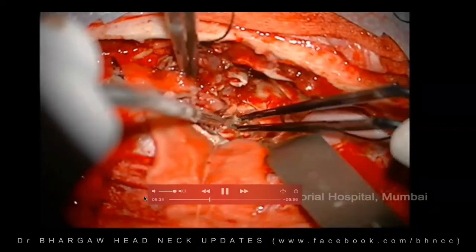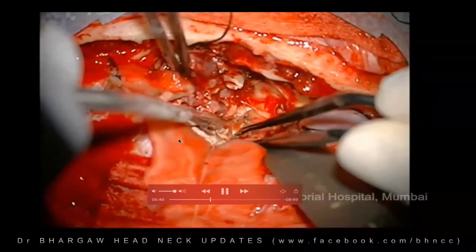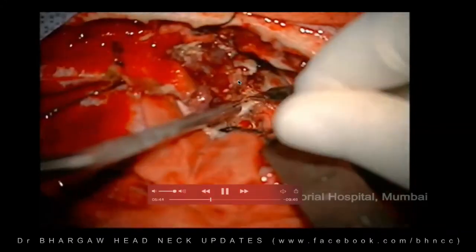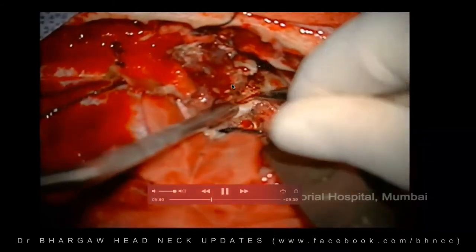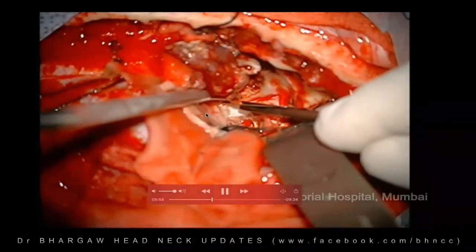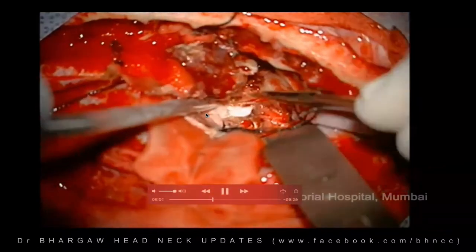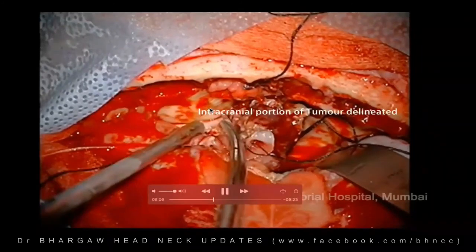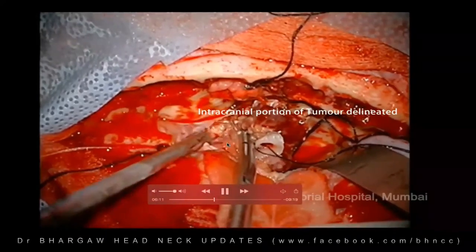The part of the parenchyma has been resected as well. The dura laterally has been resected here, laterally, posteriorly, and this laterally again has already been excised, and we have excised extradurally from here as well. So you can see that excision of the dura. You can see that's the dura closer to the planum here, but we are slightly away from the planum. The dura is again being resected here, and that's being connected with the posterior extent here.